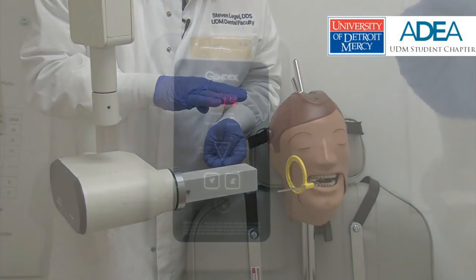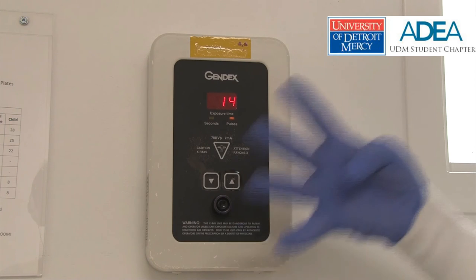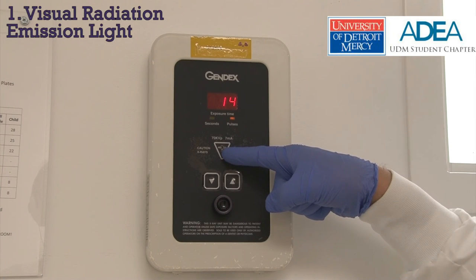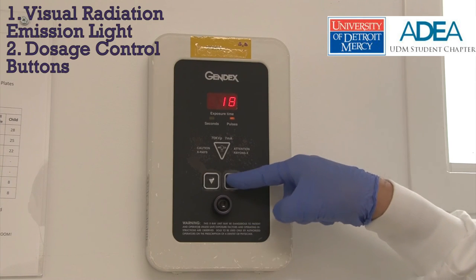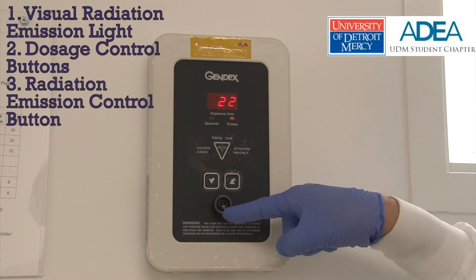This is the control panel for the X-ray camera. There are four areas of interest for the operator. One is the visual light telling us that radiation is being emitted. Second are the control buttons for the dosage as prescribed by the faculty. Also is the control button that emits the radiation. You hold the button until the sound stops.